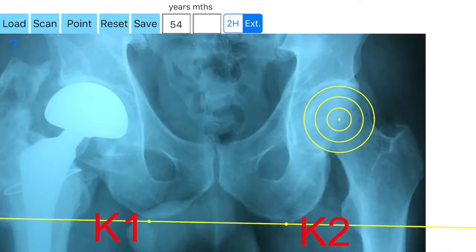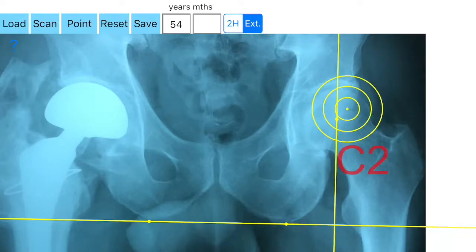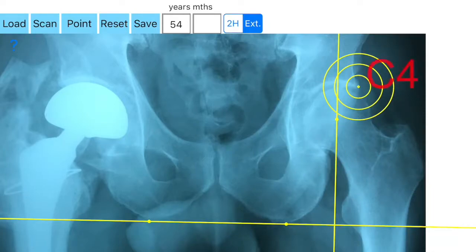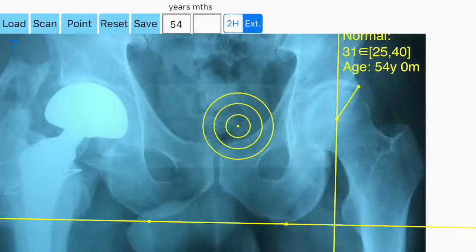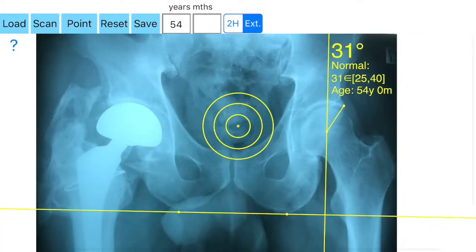HiAP is not a simple goniometer — it is an enhanced product which offers the ability to compare all input data with a medical reference database. It is a handy tool for an orthopedic surgeon in order to monitor the severity of dysplasia of the hip.